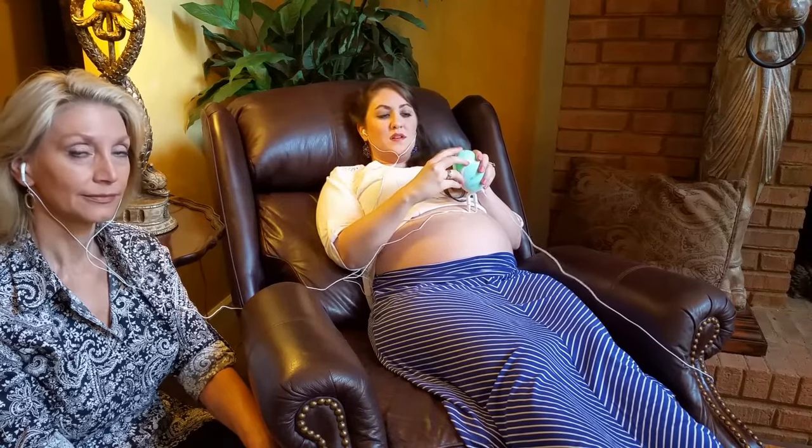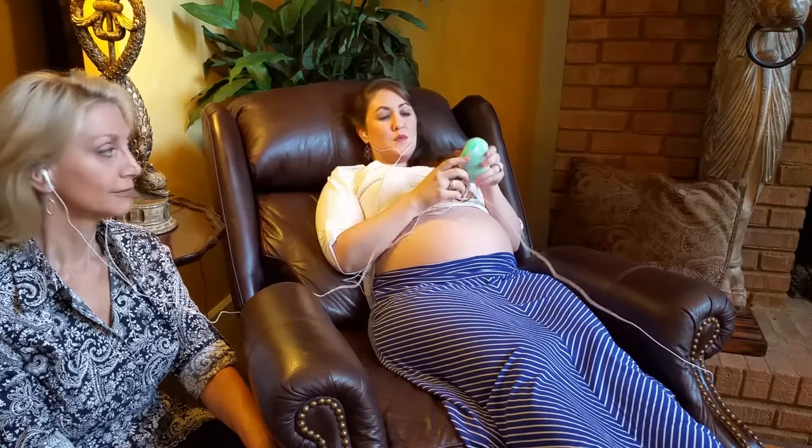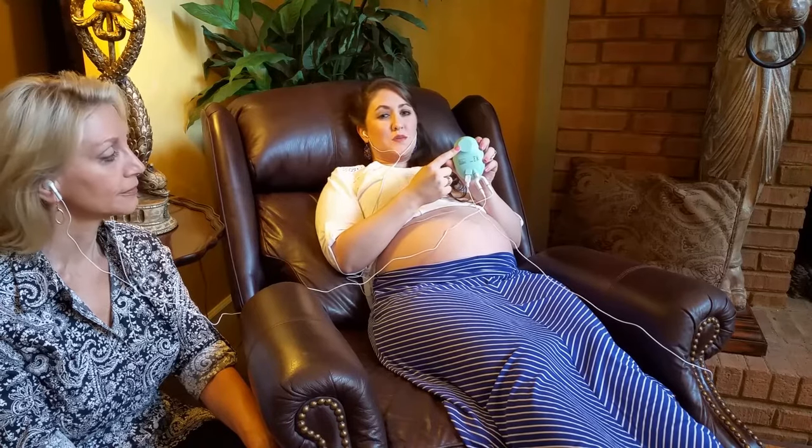The volume is on the top. I usually go ahead and turn it all the way up. On the back, this is where you will actually place it on your belly.